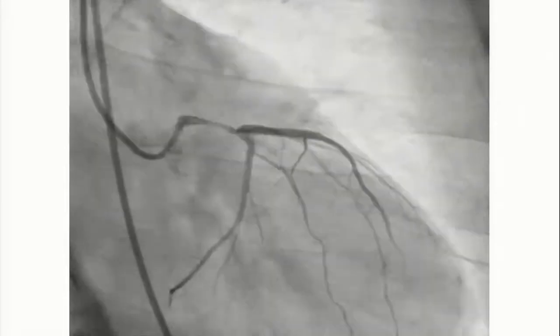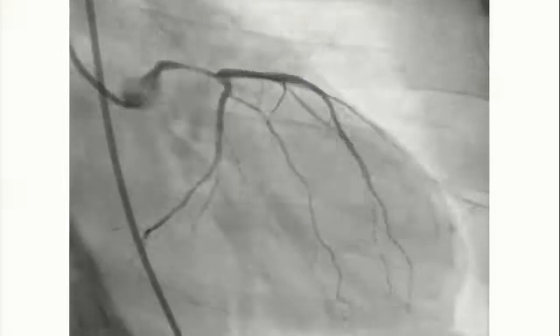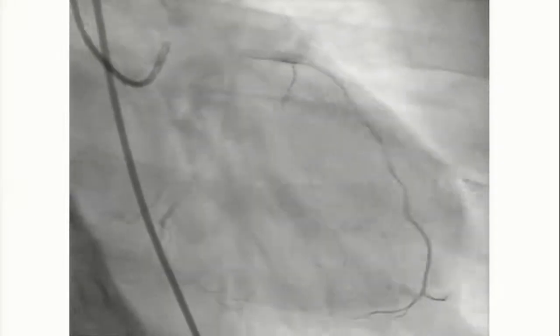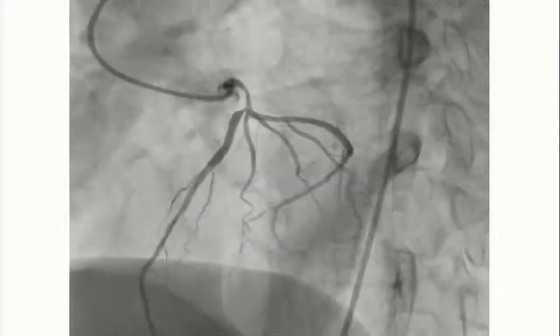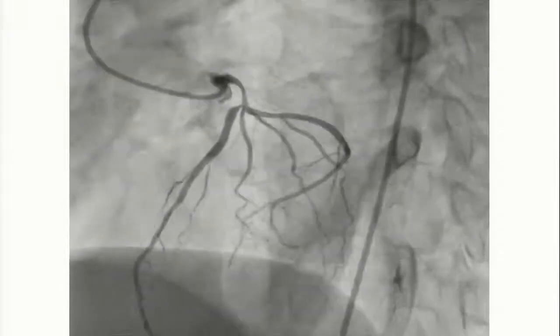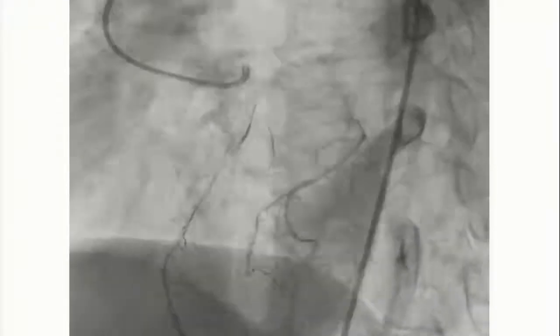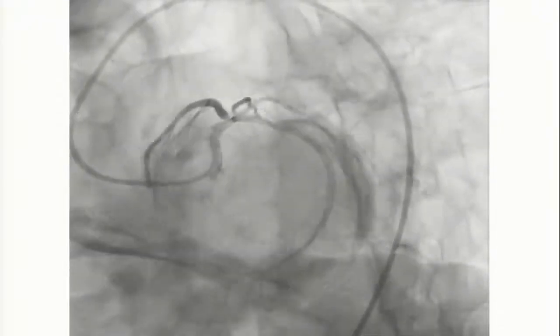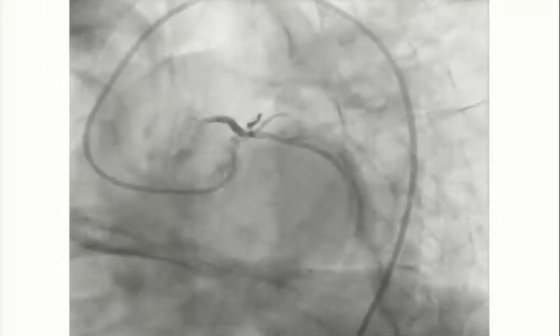And this was the angiogram. So you can see there is a diffuse left main disease, bifurcating disease. Important thing to note is it's a left dominant system. Next slide please. And you can see that the ostium of LAD is spared. So it's a type of in-segment stenosis which has come up and the stent is flowing well. We don't have the previous angiogram where we can say whether there was a disease previously present or not. And you can clearly see the left dominant system with a sparing of the ostial LAD and an ejection fraction which is normal. So we're proceeding ahead with the case.